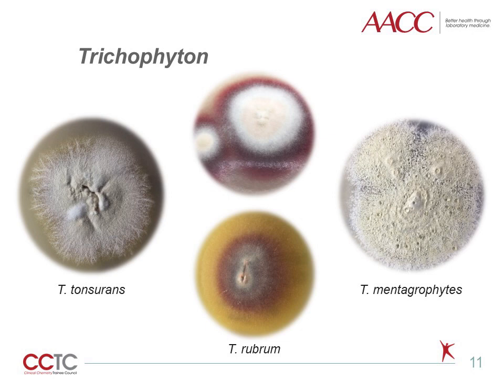On the left, we will once again begin with T. tonsurans. This mold can present as powdery or velvety with a white to yellow coloration. As with the microscopic presentation, there can be large variations with the growth morphology as well. Some colonies can have a raised center, as we see here, or can appear to be folded or have radial grooves.